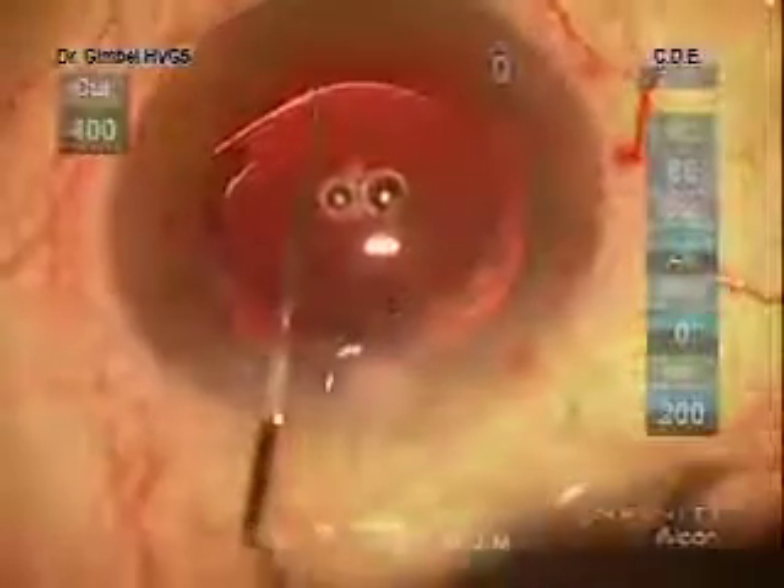You can see here how stable this is to the membrane in a central position. Looking at the eye two weeks post-operatively on the slit lamp, there's no pseudophacodinesis — it's in a centered position and the eye is quiet. The capsular membrane suture technique for fixation is recommended any time there are fibrotic elements on a capsule that can be utilized and where optic capture techniques cannot be utilized. Thank you for your attention.